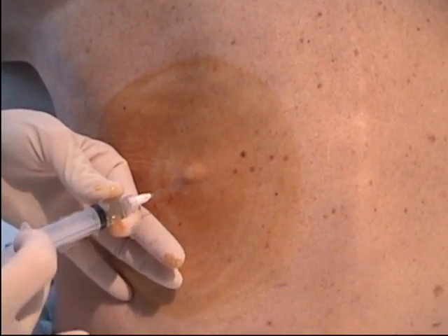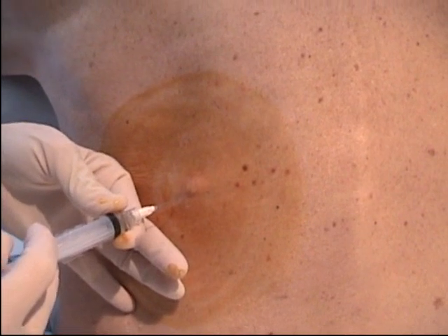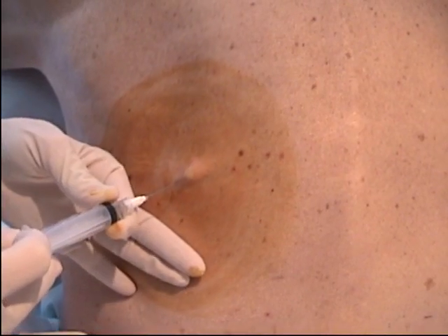Inject 2 cc's of anesthetic into the pleural space, and then withdraw the needle only slightly to infuse 1 more cc of anesthetic at the pleura. This technique provides superb anesthesia.